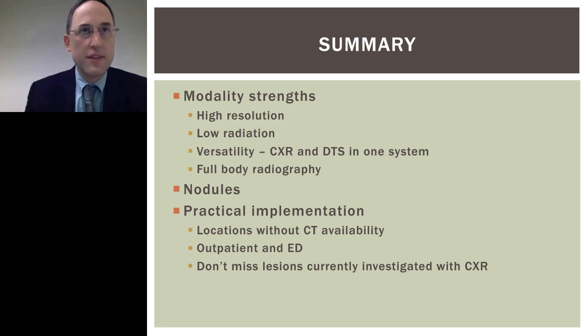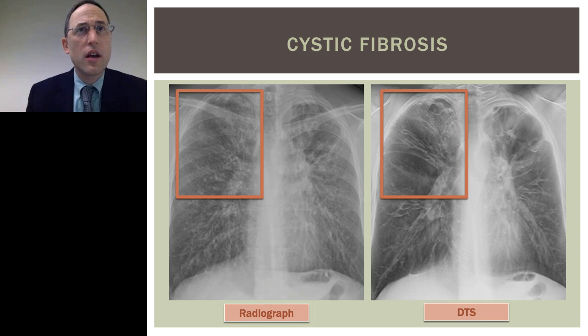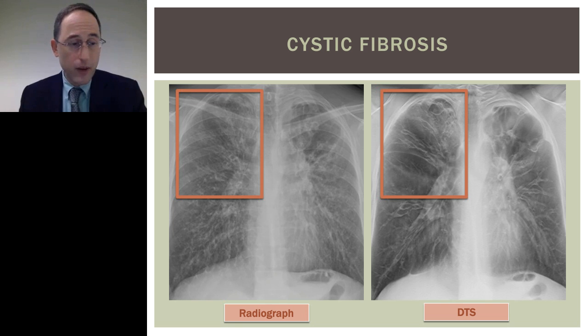doing tomo in addition to your routine modality in the beginning as people feel comfortable. Okay. Let me see. We have time for one more question. Okay, so let me see. I've got a couple questions here. There's a question here. What kind of training is available for tomosynthesis? That is also a good question, considering the prior question.